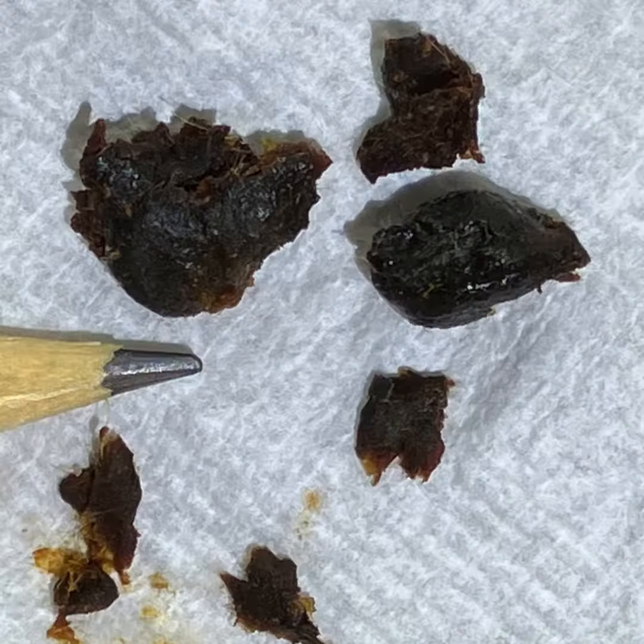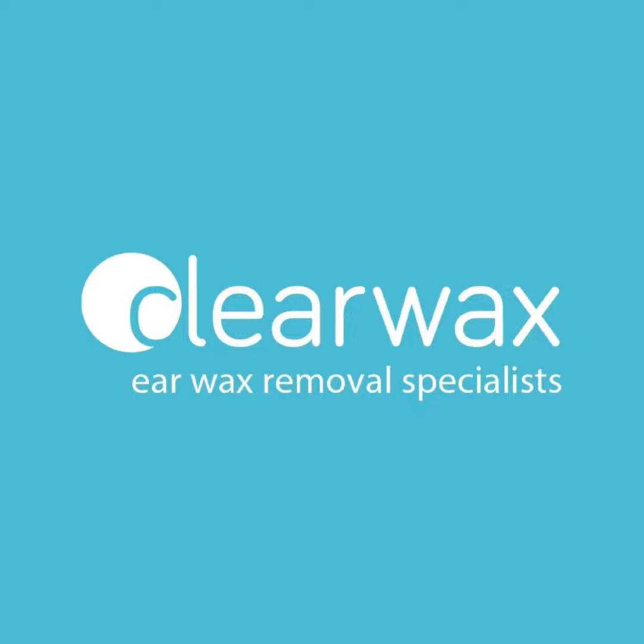I've just got some still images with a pencil tip as a reference point — you can just see how dark and dense that wax is. If you're interested in the Waxscope, please feel free to send us an email and we can add you to our mailing list. The email address is info at clearwax.co.uk. Thank you.